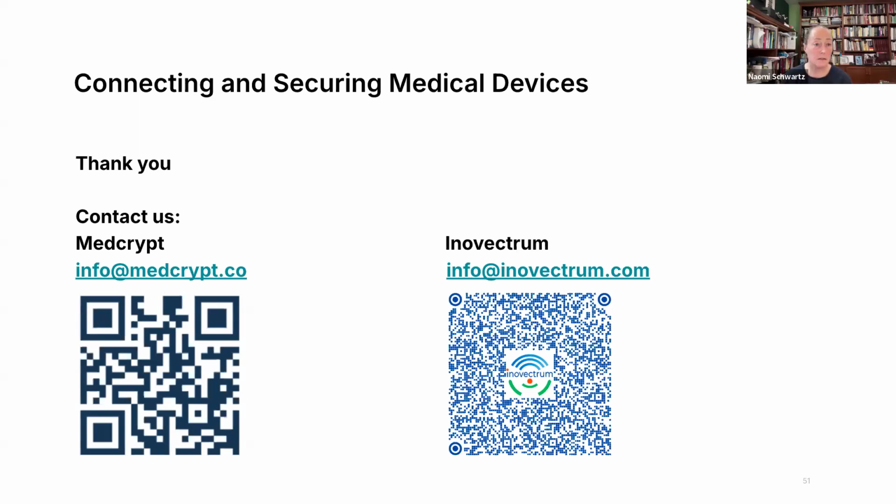I will say, and this is important, that FDA is not the final arbiter as to whether or not something like AES 128 is deprecated. For that, you need to go to NIST. Yes. NIST will tell you that, for example, SHA-1 is still acceptable for certain types of hashing behavior, but it is not acceptable for other uses, because there are elements of it that are prone to certain types of attacks that affect certain functionality. AES 128 is going to hit a big bump in the road when we run into quantum breaking of algorithms, though, and so are, quite frankly, a number of other algorithms.